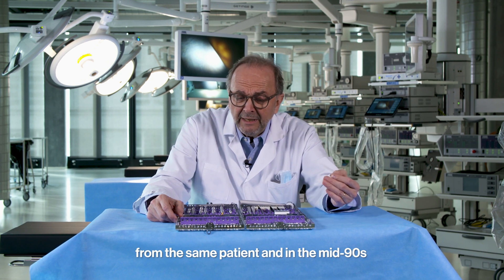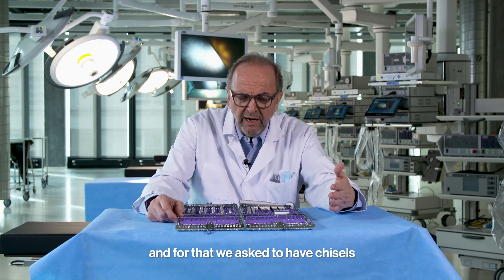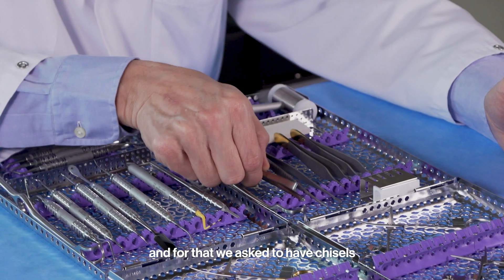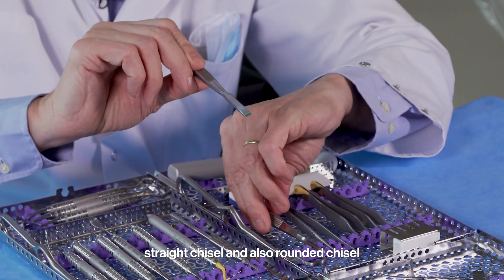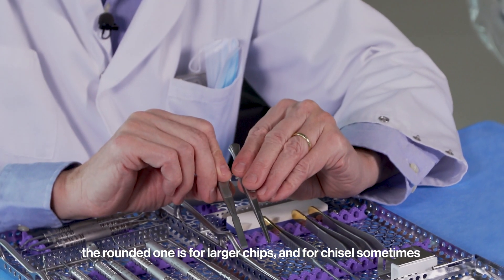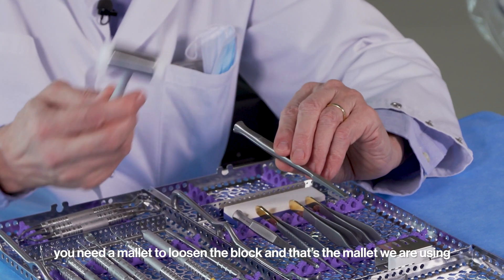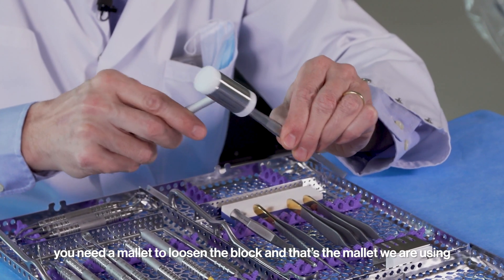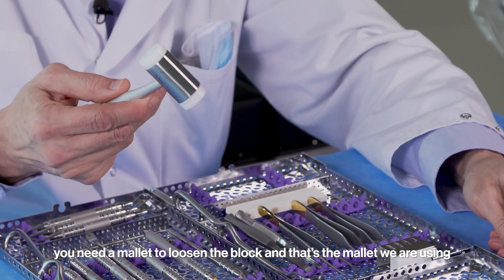In the mid-90s, we did a lot of block grafts for ridge augmentation procedures. For that, we asked for chisels — a straight chisel and a rounded chisel, the rounded one for larger chips. Sometimes you need a mallet to loosen the block, and that's the mallet we are using.